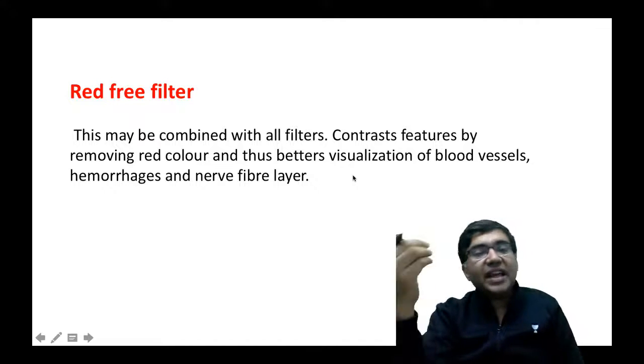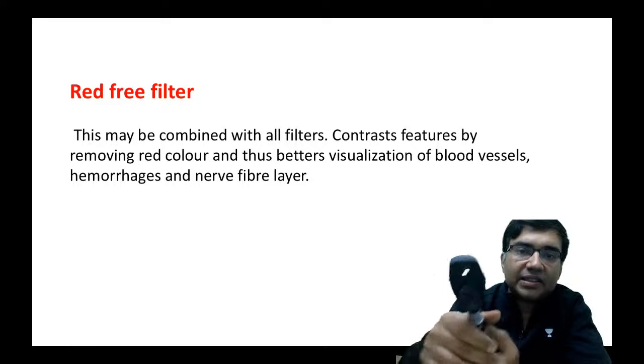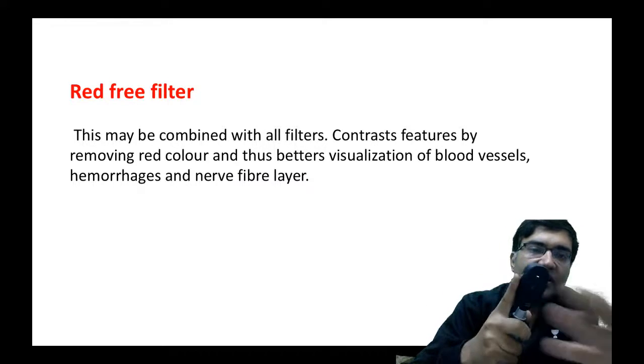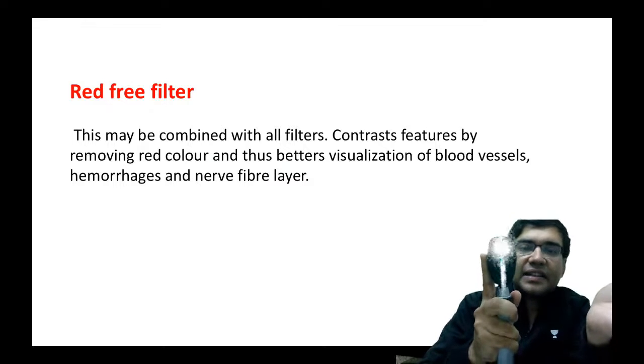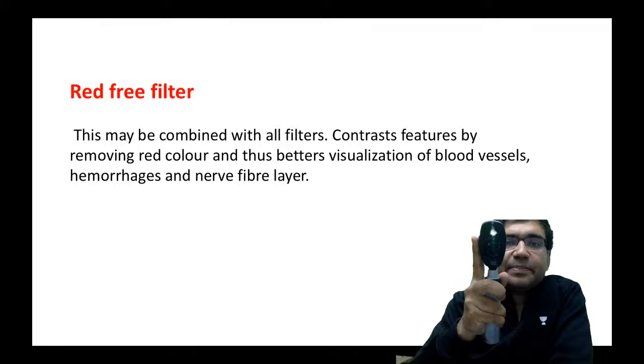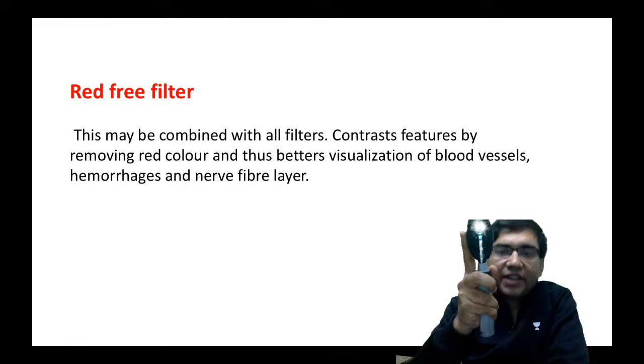Then we have a red free filter. If you can see here, I'm just making a light for you. Can you see this red light? Sorry, a green light. So basically we are using a red free filter.